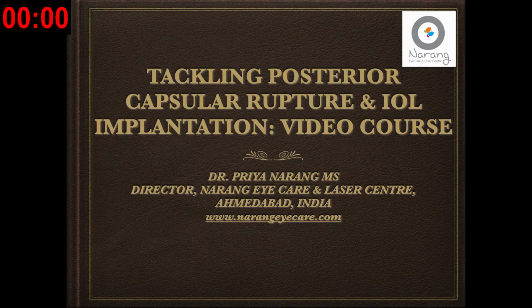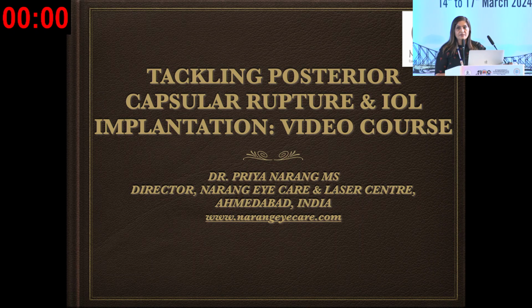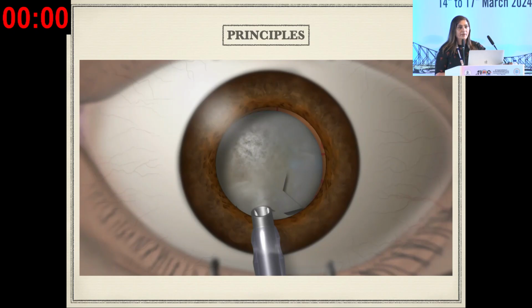So we move on to this course, and I have created some basic stuff for everybody so that there is a take-home message for whosoever is interested in picking up fine points. These are some of the animations that I have created for this. For example, this is the first one.